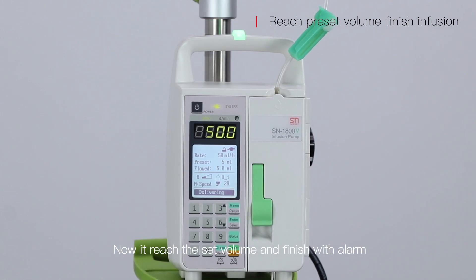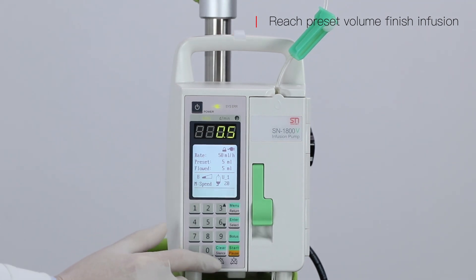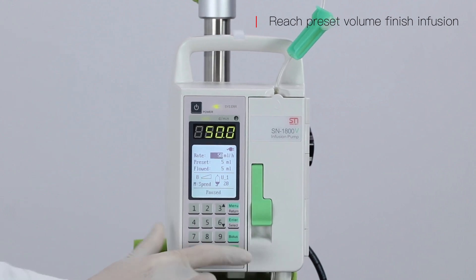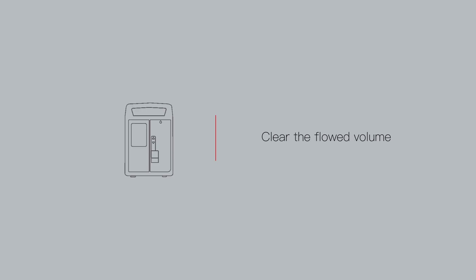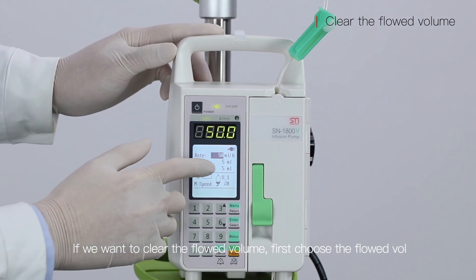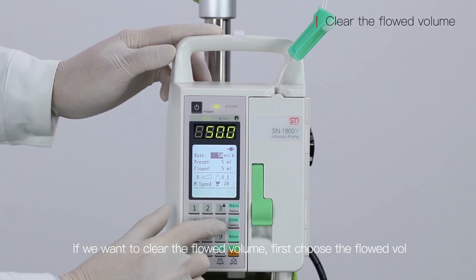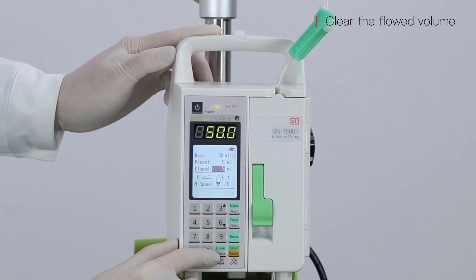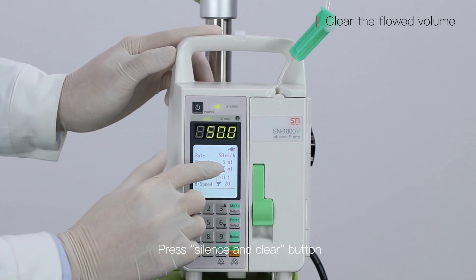Now it will reach the set volume and finish with an alarm. Press start to quit. If we want to clear the fluid volume, first choose the flow volume, then press the silence and clear button.